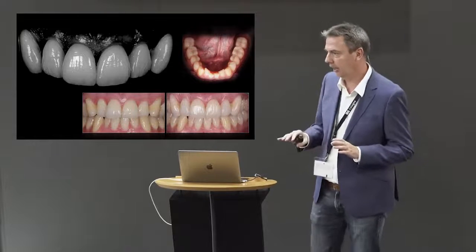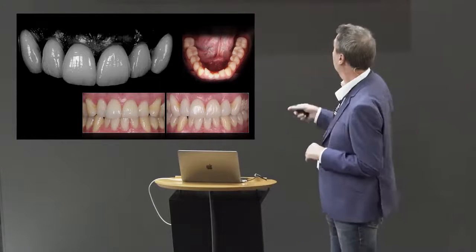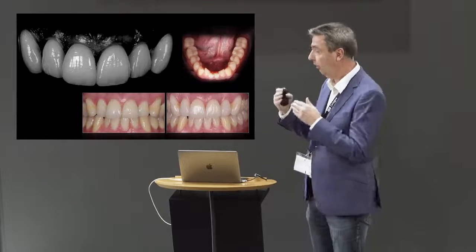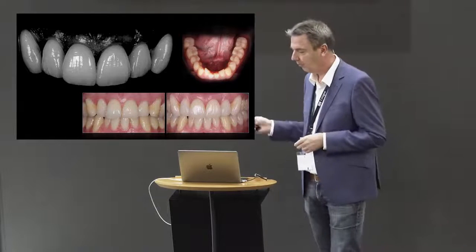We didn't touch any other tooth. Everything is additional. We did the posterior region on the lower jaw and the frontal region from canine to canine on the upper jaw.